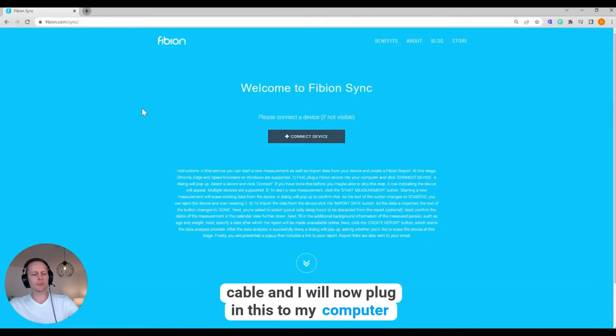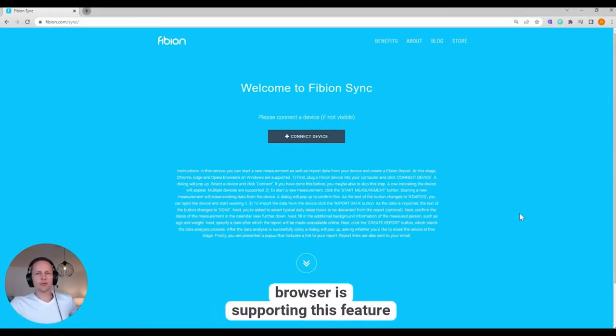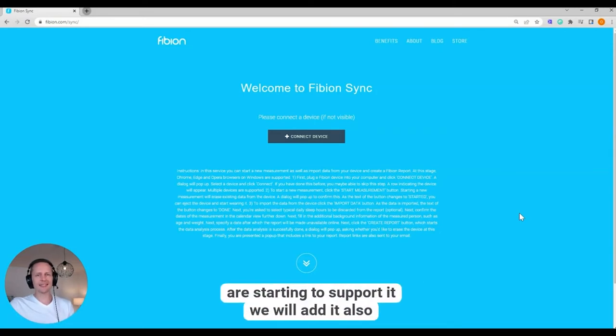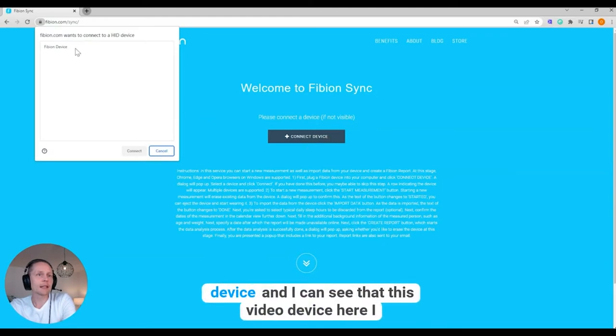Important to note: at the moment only the Chrome browser supports this feature, so it's only available in Chrome at this point. When other browsers start to support it, we will add it also. Now I have connected the device with the USB and I can click 'Connect Device' — I can see there's a Fibion device here.